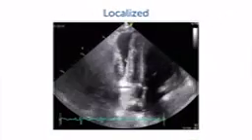Let's take a look at this patient. This patient was sent to ablation therapy because he had atrial fibrillation, and when he came back, he complained of chest pain and dyspnea. This is the echocardiogram of the patient. Now, not a good finding.